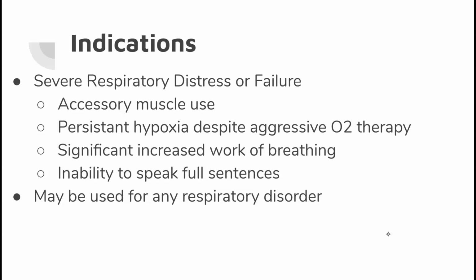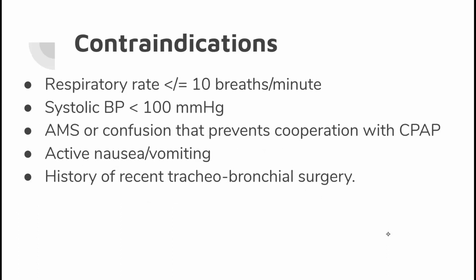You can put a patient on a non-rebreather and their SpO2 has gone up, but they're still really struggling to breathe. You might need to adjust accordingly. You might have a patient who's on a non-rebreather and their pulse ox hasn't gone up at all, but they look like they're having a little bit of a better time breathing. You don't necessarily put that patient on CPAP because maybe it's not a lung issue, maybe it's a blood issue, right? Maybe they don't have enough red blood cells or something like that. So, another number of indications. I think we've covered a number of the contraindications that would cause issues.